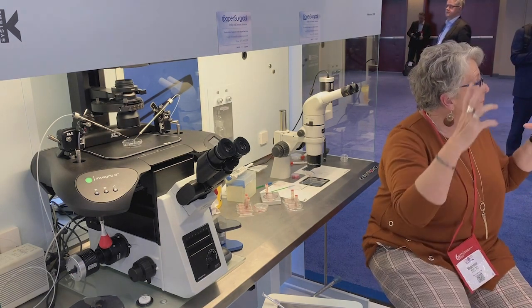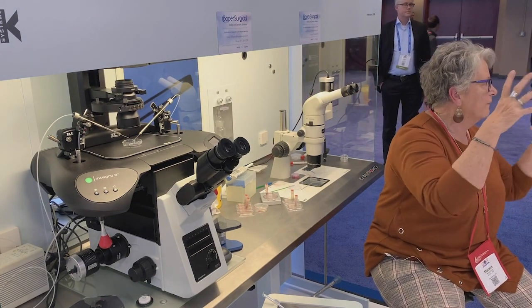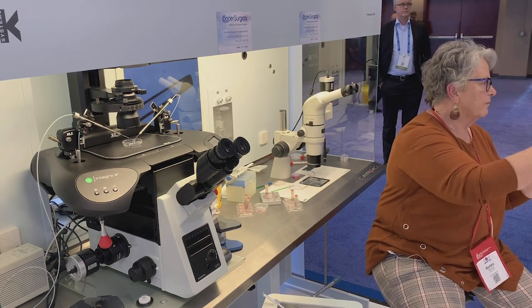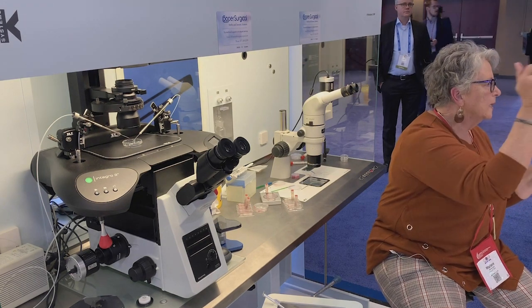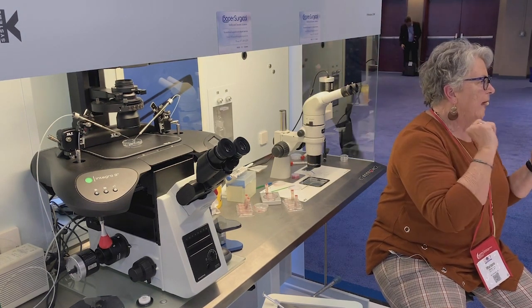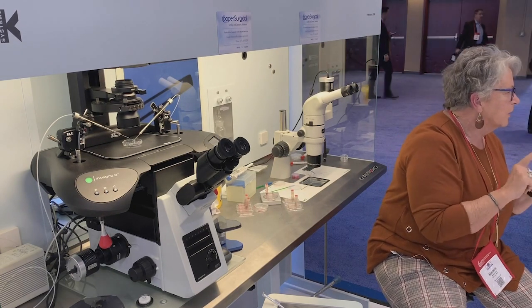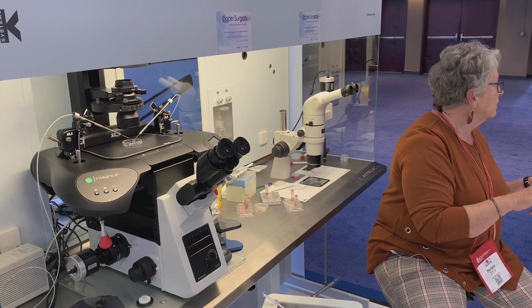The problem with the big drops is a different problem than with those really small drops. If you have a big drop, the minute you slide that device into your first thaw solution, it's going to pop off like that. And that's great, but if you're doing oocytes, that's not so good, because you want to be able to follow those guys closely around in your dish.